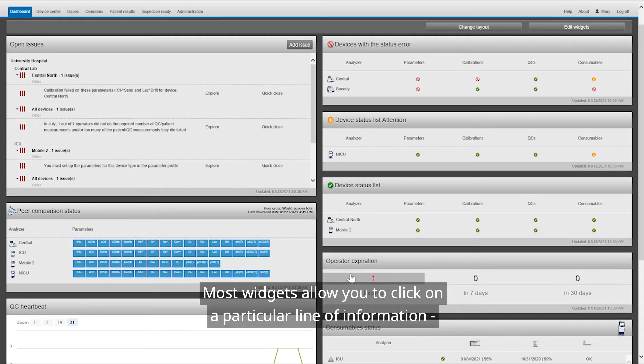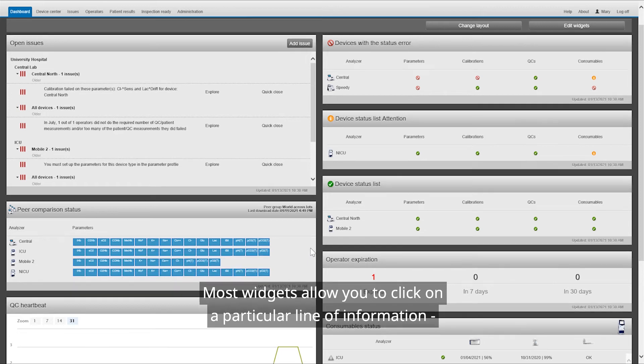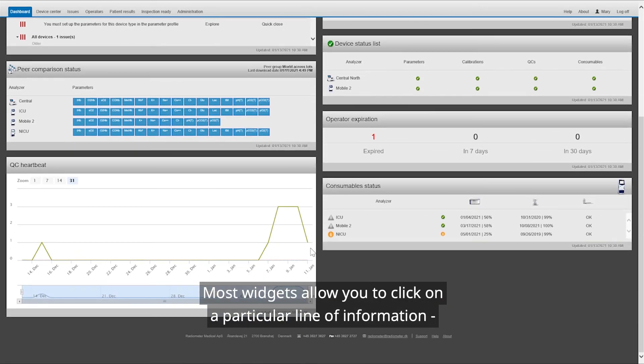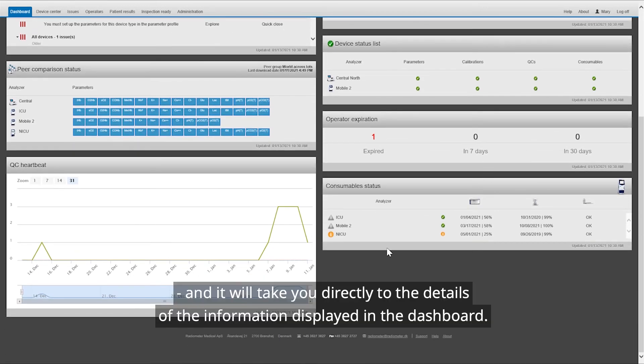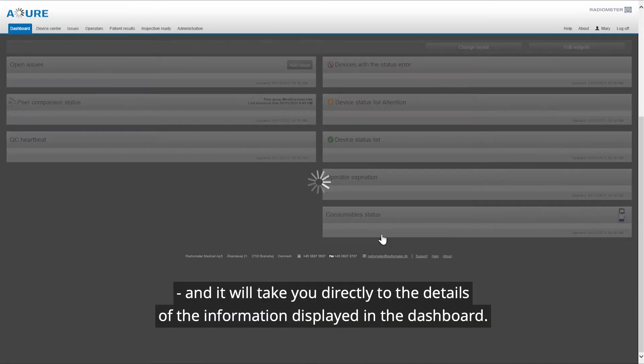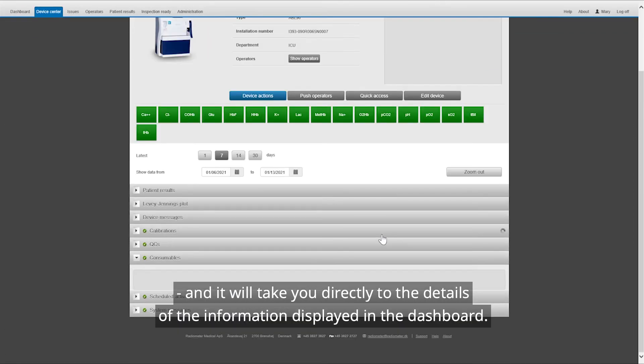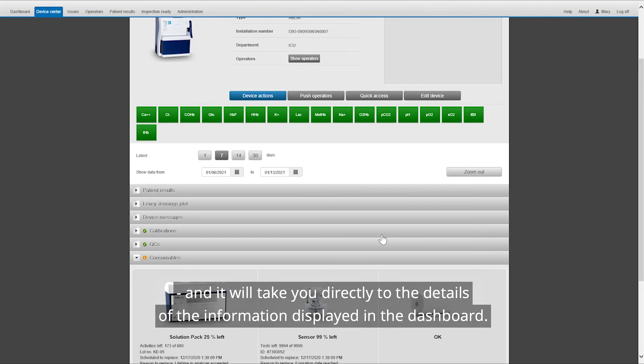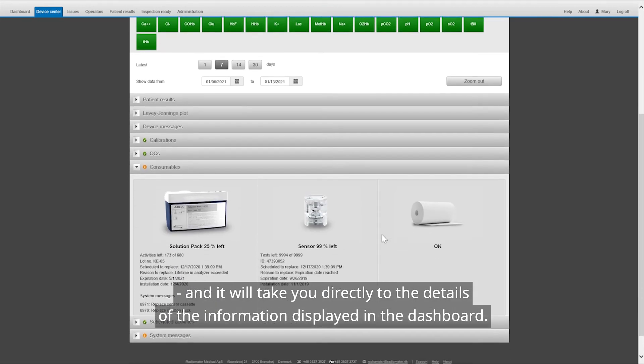Most widgets allow you to click on a particular line of information, and it will take you directly to the details of the information displayed in the dashboard.